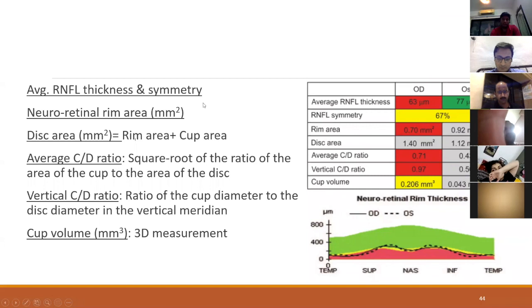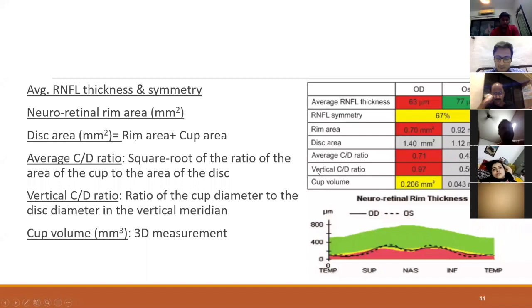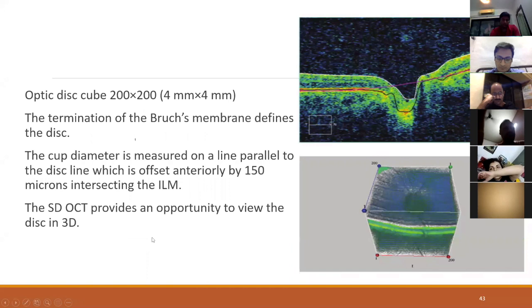The average RNFL thickness and symmetry are given in the printout. An abnormal scan would show average RNFL thickness below the typical Indian population range of 100-105 microns. A symmetry below 90%, or an interocular difference greater than 10 microns, indicates pathology. The rim area and disc area are measured. The vertical CD ratio along with rim area are the most reliable criteria for diagnosing glaucoma. Cup volume is extracted from the 3D measurement.